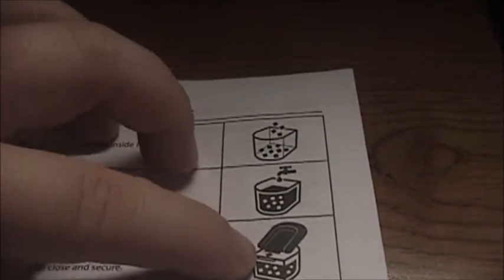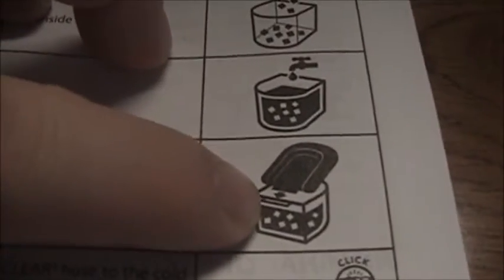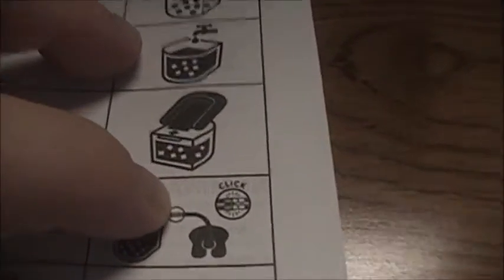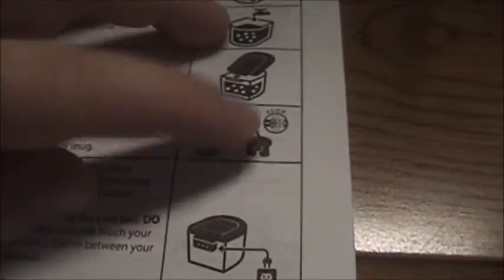Let's see. It shows you the operating instructions. It shows that you fill the actual tub with ice. Then you add water to the fill line, which you can see right there. It's right where the top of the water is. And you stick the lid on. And then you actually take the little hose. There's that connection I was telling you guys that gave me so much trouble the first night. And that's the pad you actually put around the legs. And that's pretty much it. All the rest of this is safety concerns.